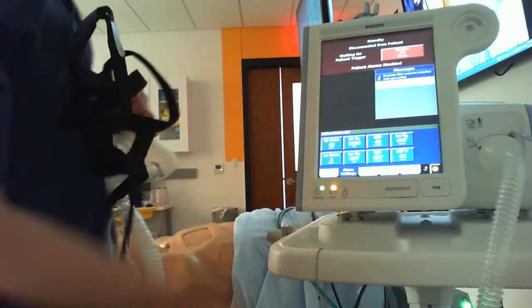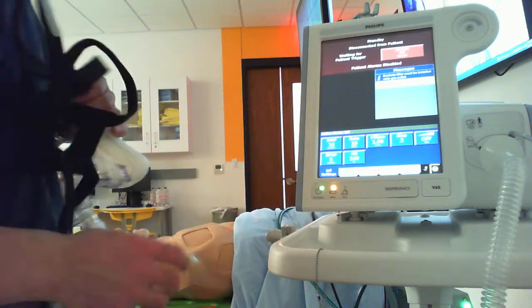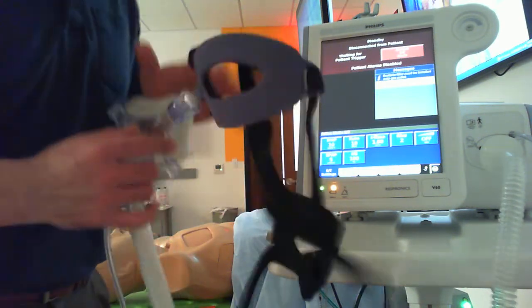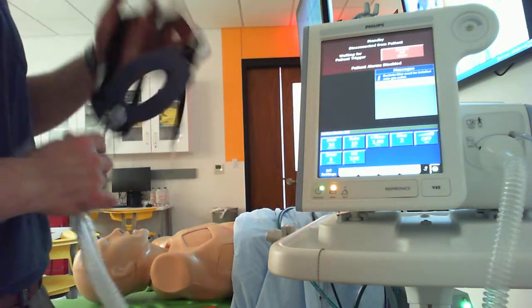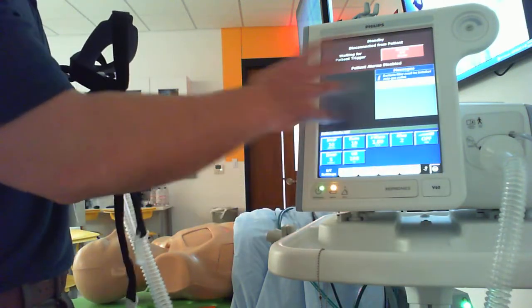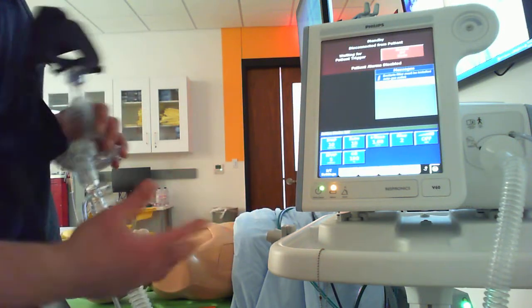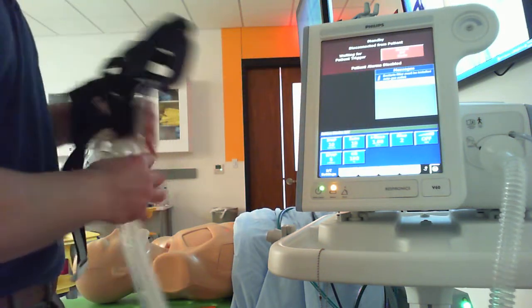So I initially like to have my alarms kind of buffered out, but I do set them afterwards. It's important to know how to silence this here, okay? So this machine, as soon as it senses an occlusion on this patient's face, it should start up. But you want to make sure, because if something is improperly connected, it may not, or if you don't get a good seal. So always a good rule of thumb to make sure gas is coming out of that device, all right, and you're actually in full-on ventilation.